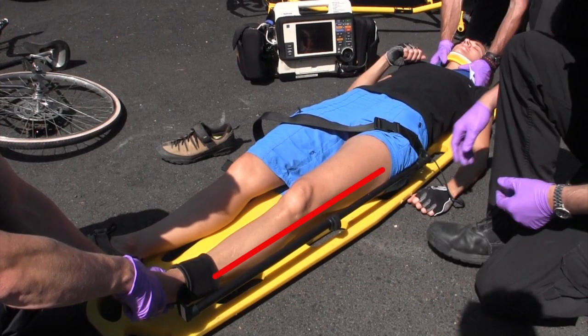Notice that the pole does not extend past the patient's foot. This is a tremendous advantage during evacuation and transport, especially in helos, extrication baskets, and other confined spaces.